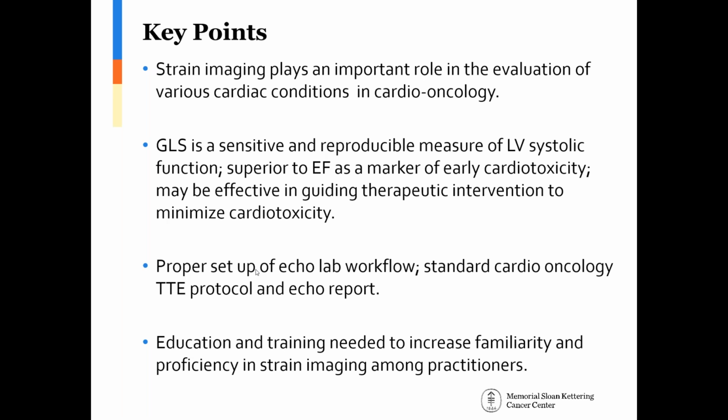Dr. Liu, this is Isaac Ray. I'm actually down at UT Memphis now. I've been at 3 different institutions that have used strain, and in all of them only the sonographers did the strain. There's no real way to do an offline remeasurement.